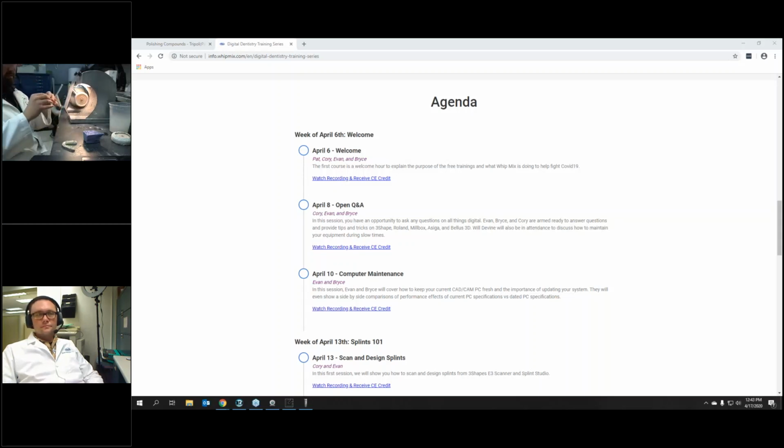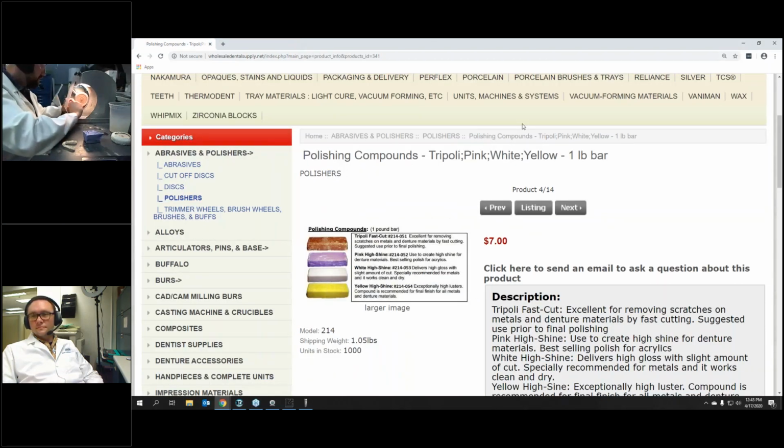All right. So I don't know if Dan, you're watching this, but if you ask me, this looks pretty dang clear so far. Oh, let me get rid of some of that polishing compound. It's kind of hard for the camera to focus on it because it's so shiny. But on this surface, you can see it is frosted looking, but that's because of the layers. We cannot polish that part. However, this side here, it's pretty transparent. Yeah, just being able to see the surface. If you can see the contour of the teeth, that means it's pretty much crystal clear at that point. Dan says he believes you.